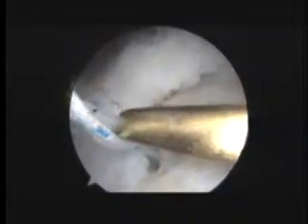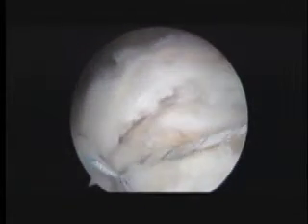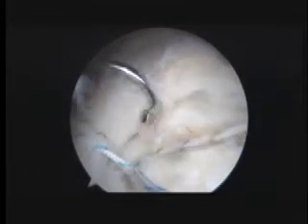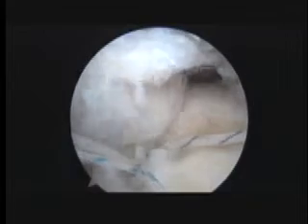Okay. And so now out of the front, on the right side of the screen, we're going to take the black and white striped one. And then we'll take another suture hook. This is what we call a turn to the right hook. Here's the hook coming in. Show me the end again. Okay. Coming through. We'll feed that through. Pause.